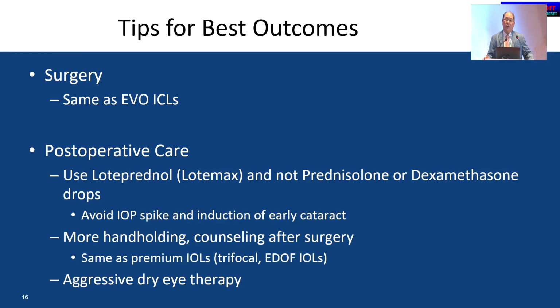Again, with presbyopia patients, when you treat, it's hard to promise everything. So we counsel the patient, same as with a trifocal and same as with an EDOF, that there's a little bit of trade-off. You won't get perfect far, you won't get perfect near, you have somewhere in between. But it helps you with day-to-day life, and it helps to have aggressive dry eye therapy.